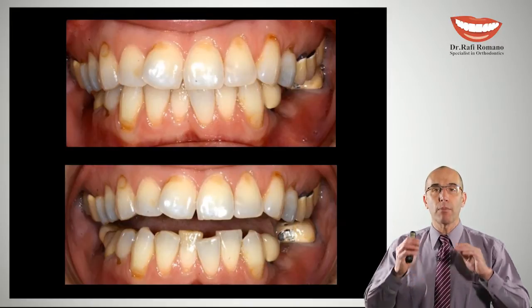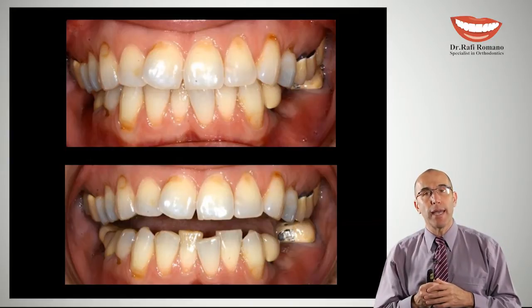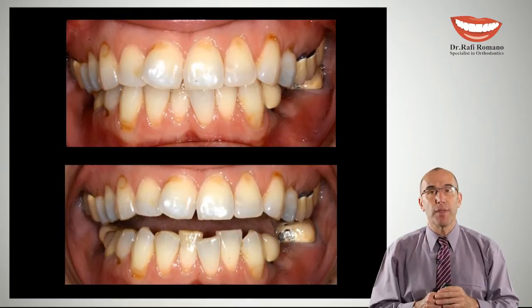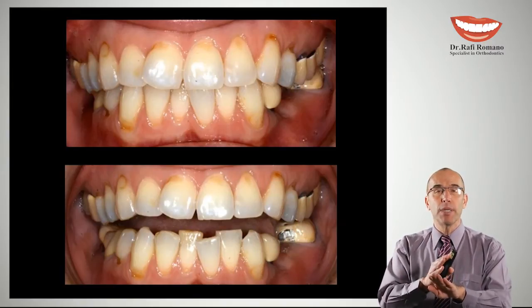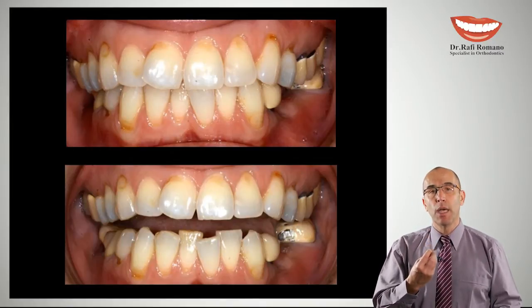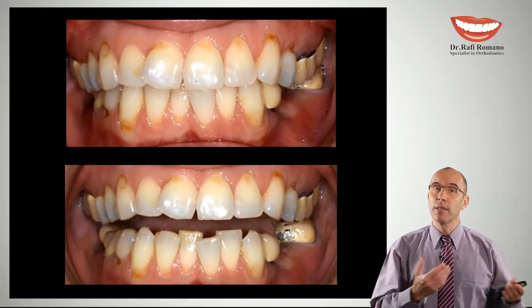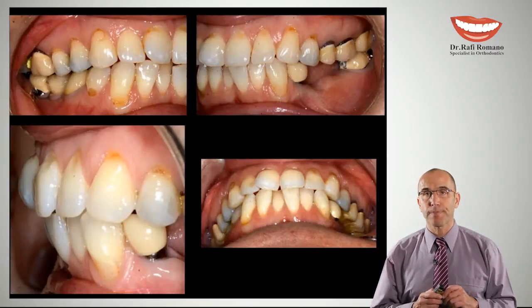We have some attrition and breakage in the incisal edges that should be taken into consideration when we place the bracket and do our uprighting of the teeth. We have some crowding and overlapping between the teeth, so we have to plan how we want to solve this case: just by proclination, or by extraction, or by interproximal stripping, IPR.